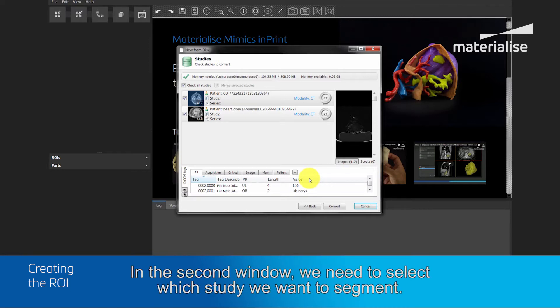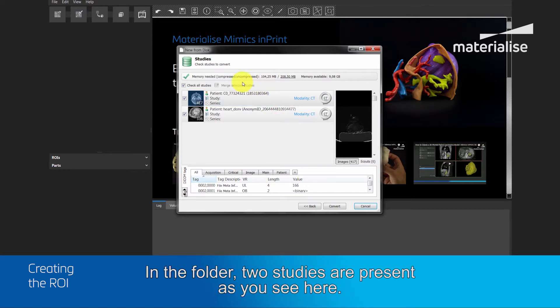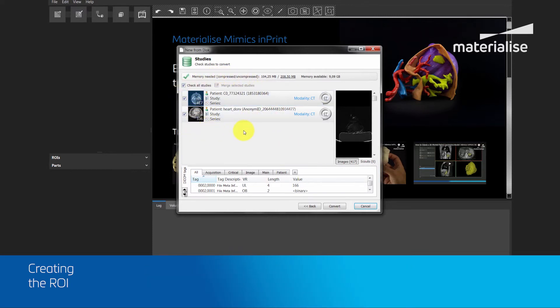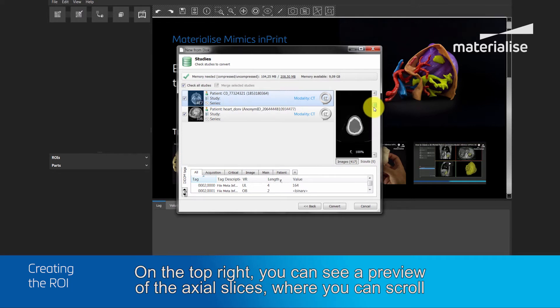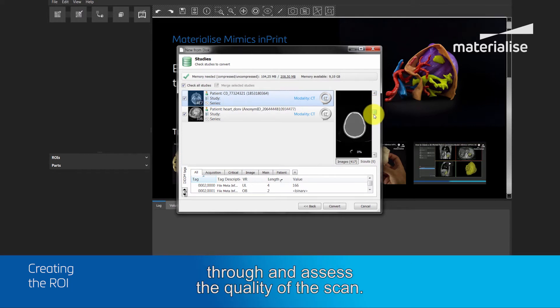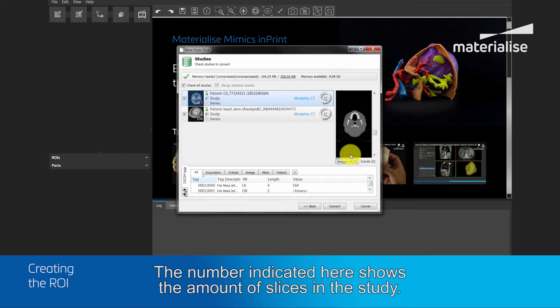In the second window, we need to select which study we want to segment. In the folder, two studies are present as you see here. On the top right, you can see a preview of the actual slices, where you can scroll through and assess the quality of the scan. The number indicated here shows the amount of slices in the study.